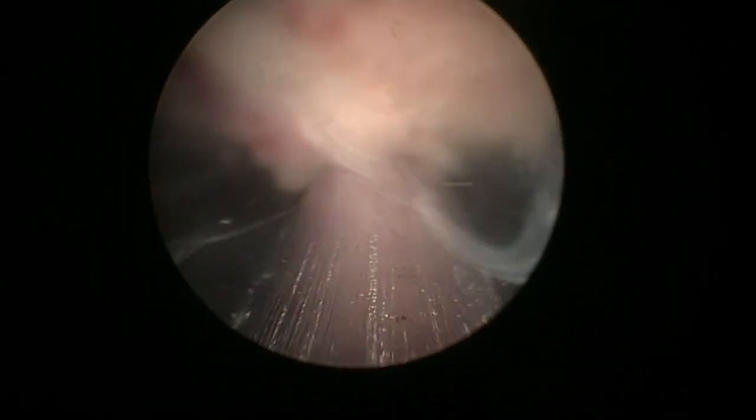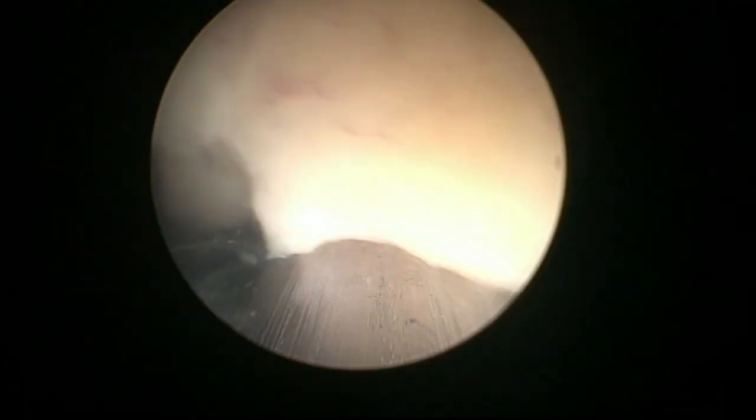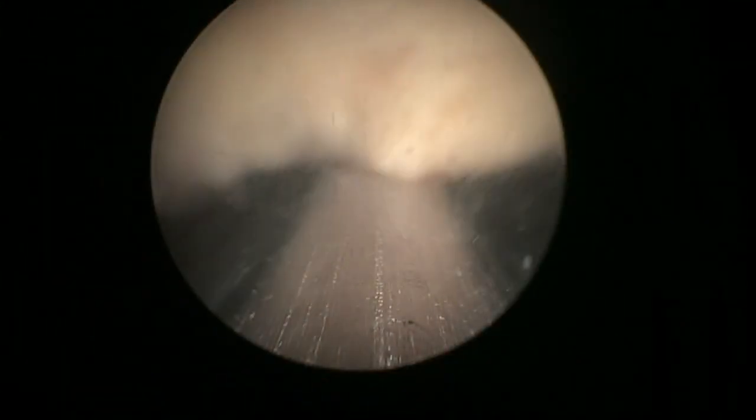You see, when morcellation is efficient, the mouth of the blade is covered by tissue, so there will be a lot of tissue coming out and a reasonable amount of water. Whereas if we have an inefficient morcellation, there will be a lot of suction of water and the bladder can empty. If the bladder empties, there's a chance to catch the bladder with the morcellator and produce a bladder mucosal lesion. So that's why it's important to keep checking.